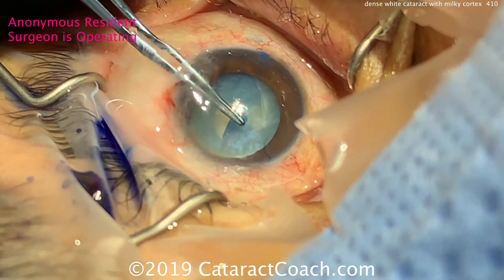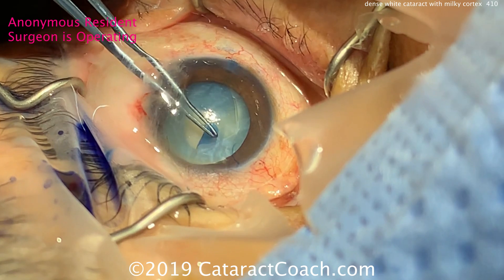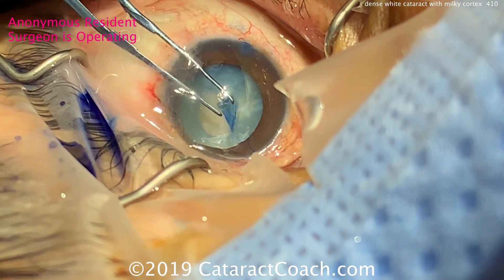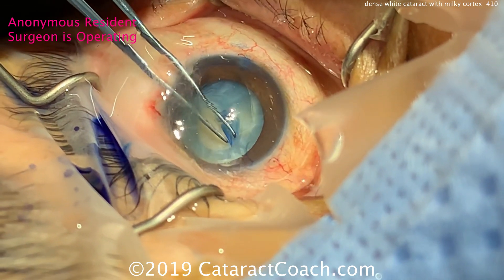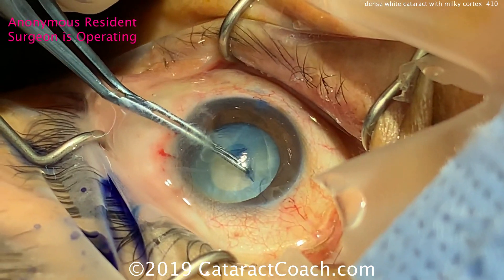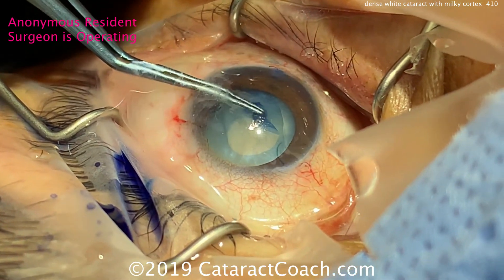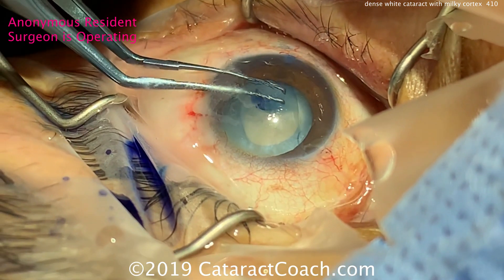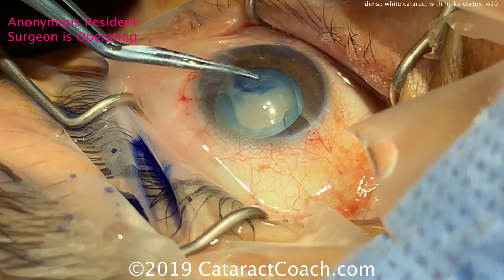Another option is to just continue the case. You can see the difficulty he's having in trying to grab the lens capsule to complete the capsulorrhexis. Part of it is technique — this is a new surgeon who has only done about 50 surgeries. The other part is the patient is having less than ideal cooperation, and of course, it is a challenging and tough case.